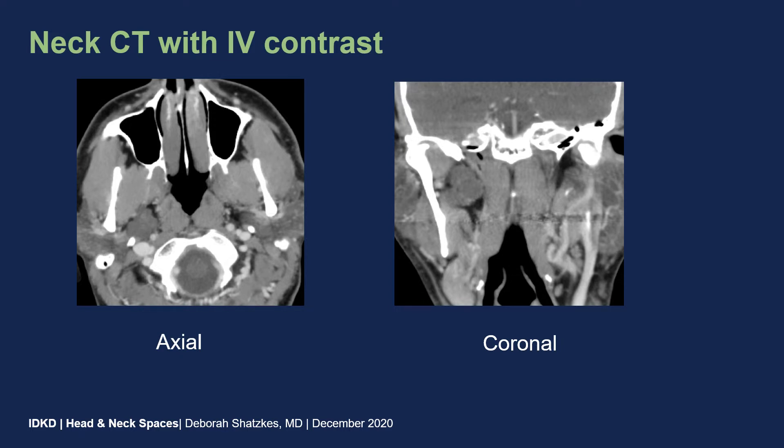He underwent neck CT with IV contrast. I'm not going to show you his mandibular lesion, which turned out to be a focus of cementoosseous dysplasia, but I am going to point out an incidentally discovered lesion on that neck CT. We have axial and coronal images, and we can see that there is some asymmetry on the right side, and there is a lobular low-density mass lateral to the nasopharynx.